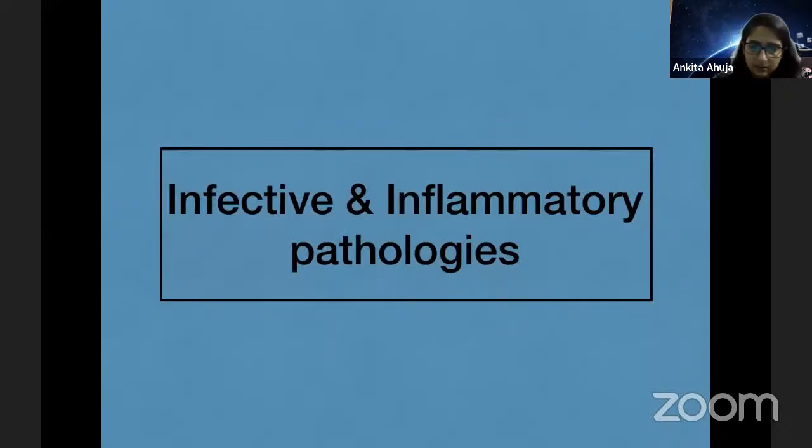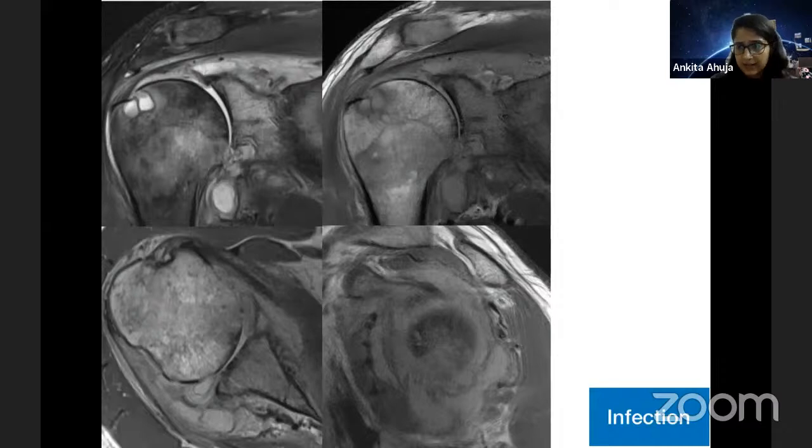Now, lastly, touching upon the infective and inflammatory pathologies. First of all, before beginning this, in quite a few situations it might be difficult to differentiate something as a chronic infective versus inflammatory pathology. And in such cases, clinical input and inflammatory markers are really helpful. So how long standing is the history, how are the clinical markers, all of those play a role. This is a classic case of infection. So how do I see that? Let's see this case first.